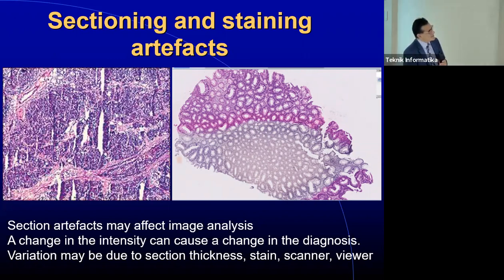Here, it's even brilliant. So this is about 2 millimeters, and within that space you've got lovely staining here, and there's a water blob which has got into the stain here, and it's prevented the staining going on here. Now, for the non-pathologists, if I say to you, are there any differences in this tissue, you say, well, yeah, okay, that is different from that. But we as pathologists know that actually this is all one piece of tissue showing exactly the same thing.